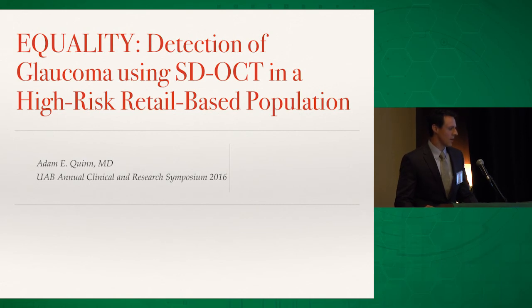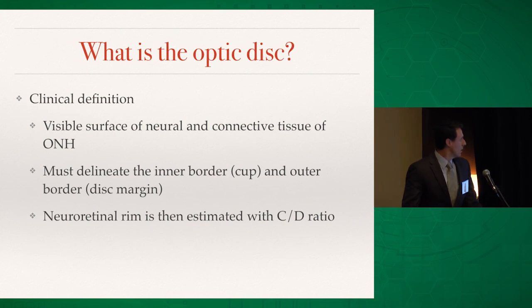So I'm going to talk about a relatively new OCT-based parameter that might be able to help us in diagnosing glaucoma and maybe even the progression of glaucoma. So we'll start with some basics first. We'll talk about the clinical definition of the optic disc.